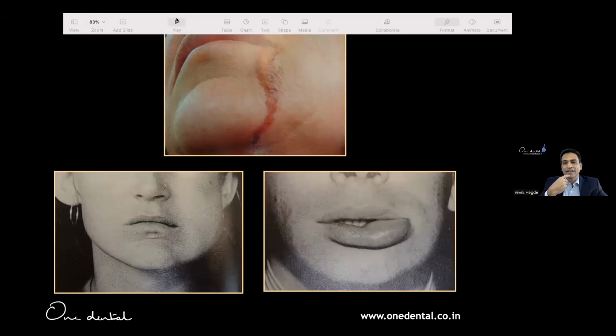There was a block given and the hypochlorite leaked so much till the bib got dirty. But the patient was sensitive, the skin was sensitive. A lady patient, imagine. Anybody will excuse you for anything that you can hide maybe. A face value? Definitely not. It was a big issue in that clinic. I know what happened. They went to a skin specialist. They gave them all steroid creams and whatnot. That patch, that burn, chemical peel took a long time to settle. You'll not be excused. And that's not possibly your mistake. The only mistake was there was no Luer lock. That's it.